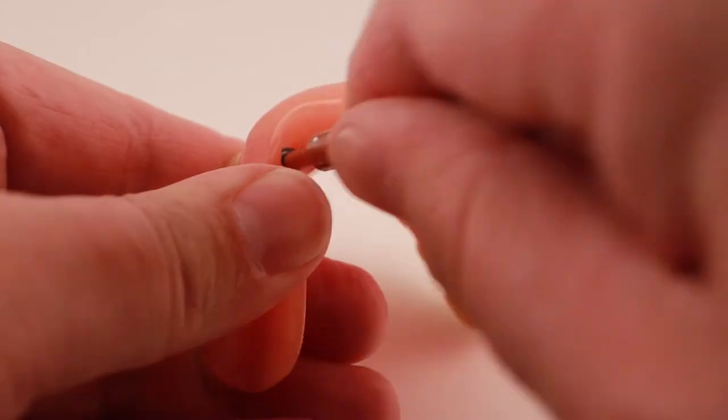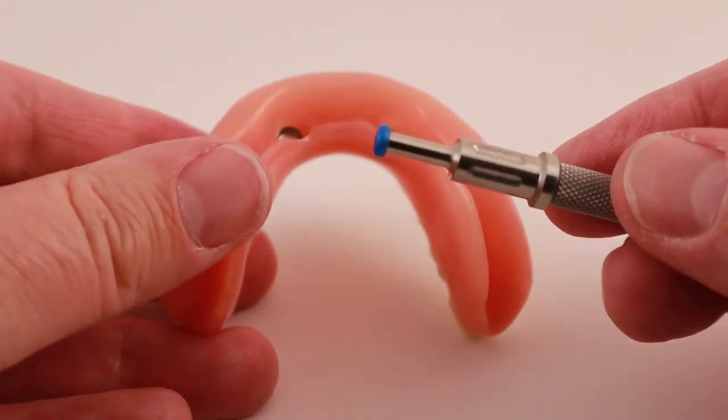As you wear your snap-in overdenture, the plastic snaps will eventually wear out and get loose. Replacing them with a new snap is usually a quick, easy office visit.